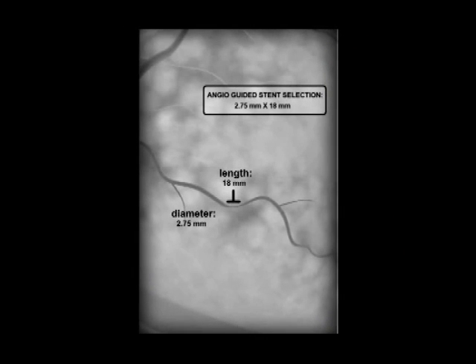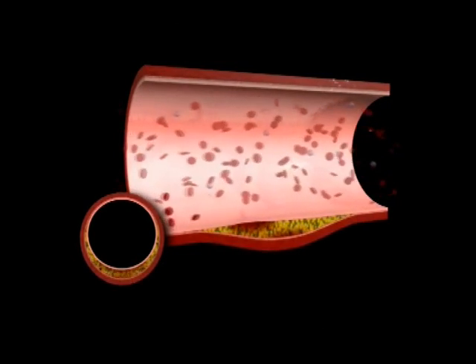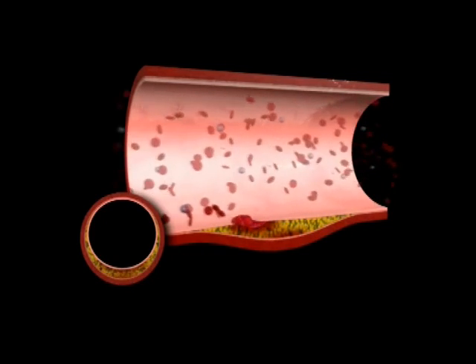...or other hyperemic agent to achieve maximal hyperemia. This ratio represents the fraction of normal blood flow through the stenotic artery. A normal FFR value for all vessels under all hemodynamic conditions is 1.0.